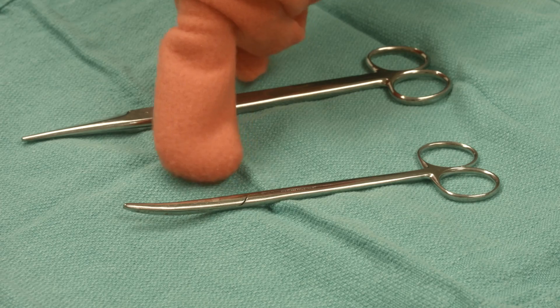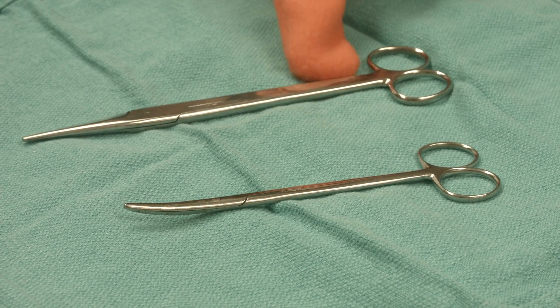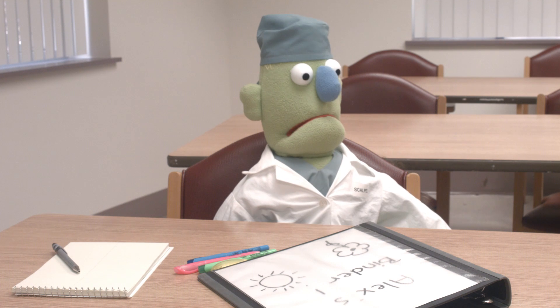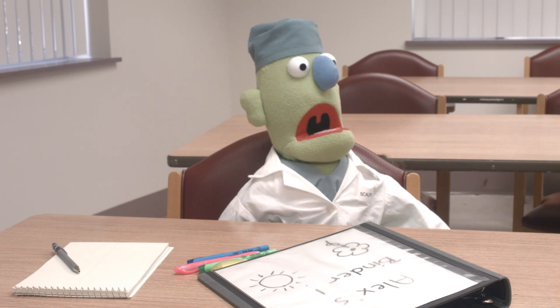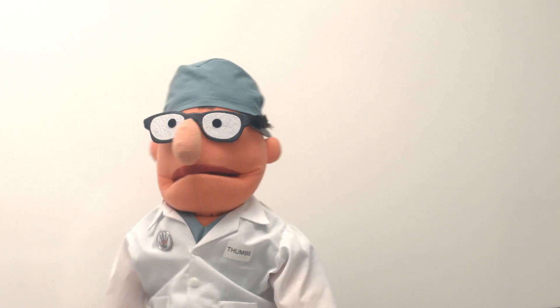Obviously, scissors are used to cut things. There are two basic types: tissue scissors and suture scissors. Tissue scissors are usually fine and light, like this nice pair of Metzenbaum scissors. Suture scissors are usually heavier, like this pair of Mayos. It's important not to mix the two types up — that's a real rookie mistake in the OR. Never use tissue scissors to cut suture, and never use suture scissors on tissue.